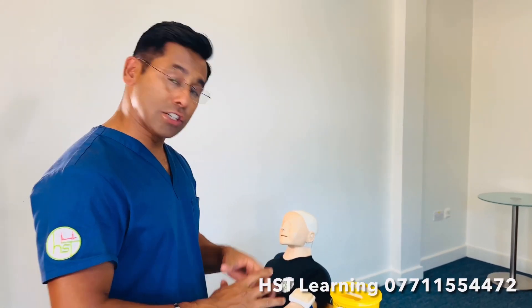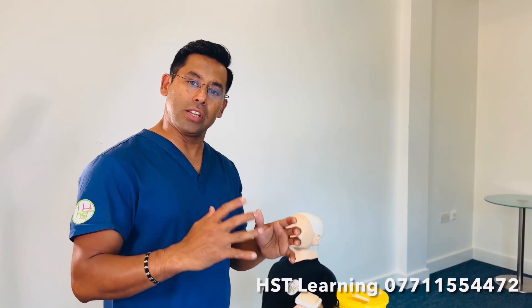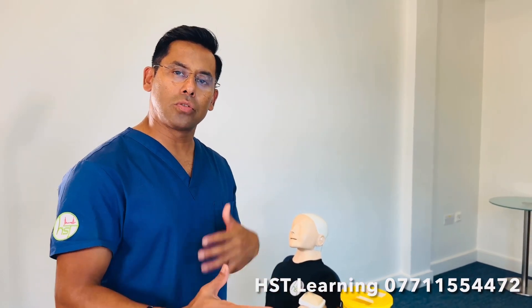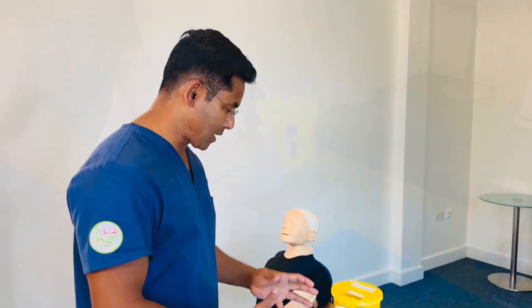Subcutaneous injection: let's look at how to avoid the scooping technique or resheathing the cap. Without resheathing the cap, how am I going to give the injection? Let's look at how to avoid these errors.